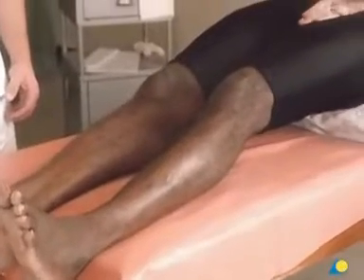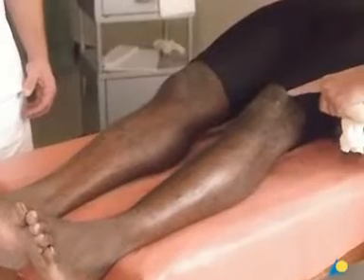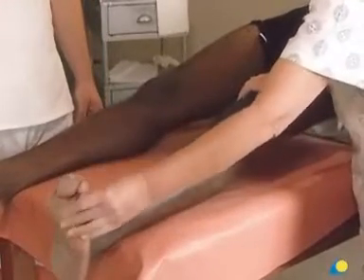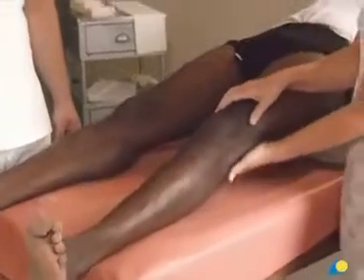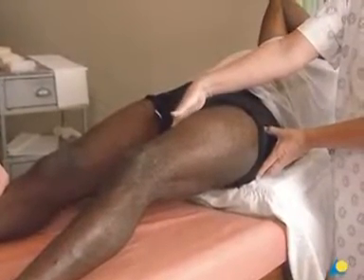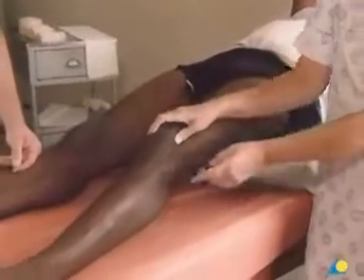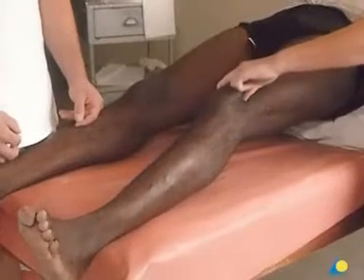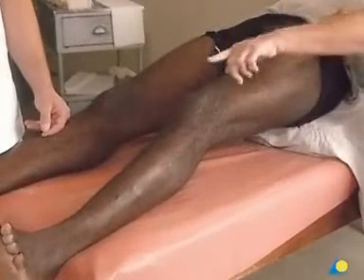After reduction, the leg is supported by an assistant, who will check to ensure that there is no rotation of the fracture by verifying that the second toe, the patella, and the superior iliac spine remain in line. The distal border of the cast is located at the metatarsal heads, while the toes should remain open. The proximal border of the upper leg circular cast lies just below the greater trochanter on the lateral side and just below the groin on the medial side. Care must be taken to avoid pressure on the fibular head and neck area, to prevent pressure to the peroneal nerve that could cause neuropraxia or nerve damage.